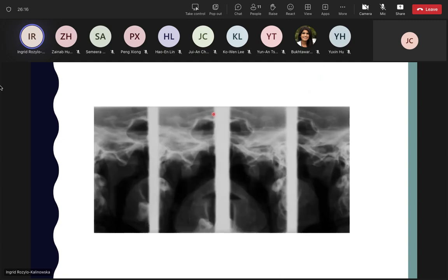And as mentioned, we still take these radiographs. So this is a radiograph of just TMJs, but this is the right side. This is the left side, and if you pay attention, you will see the difference, because in this image, the condyle is in the glenoid fossa, so mouth is closed, and in this case, the condyle is on top of articular eminence, so the mouth is open.